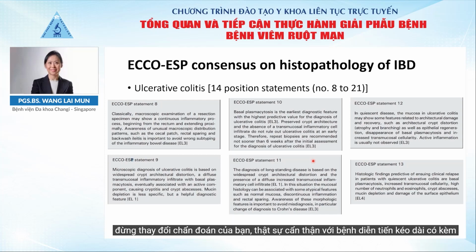Be aware that in long-standing disease with treatment, you do get patchiness, where you like to see diffuse disease initially, when you make the diagnosis, that changes over time with good treatment and relapse as well. So just be aware that patchiness can happen over time due to treatment effect, and you should not change the diagnosis to Crohn's afterwards.